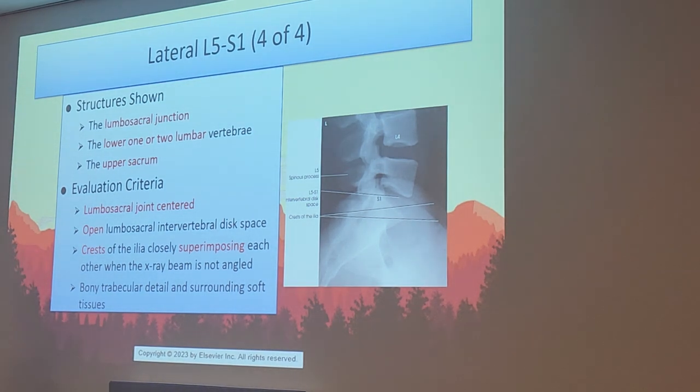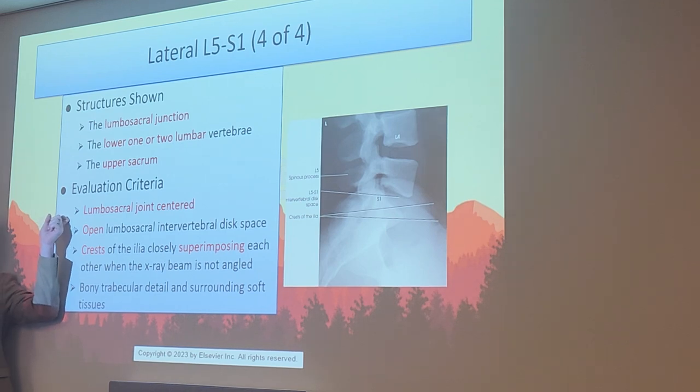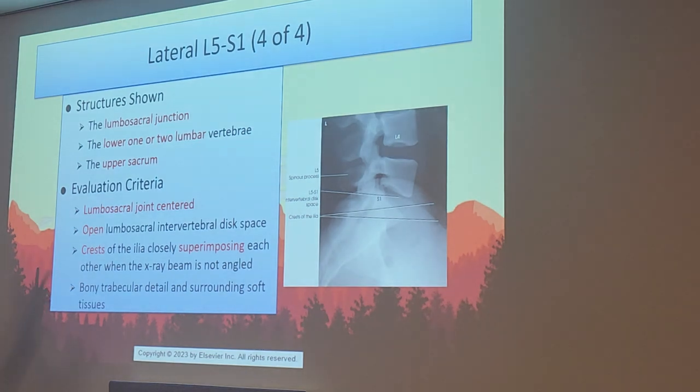Keep that in mind. Then you also, of course, want to see the upper sacrum, not the entire sacrum, because we're not doing a sacrum x-ray yet. This is just the joint space. And then, of course, you want the star of your show to be centered. How do you do that? You do my little technique I showed you today, or I'm going to show you here a little bit. If it's not centered, it's going to very quickly degrade the quality of that film. You've probably seen some pretty ugly films in this clinic. A lot of it has to do with the centering, lack of shield absorbing scatter, and lack of proper kVp and mAs settings. Very finicky x-ray if you don't execute it correctly.